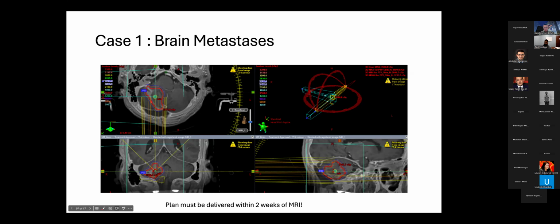There is retrospective evidence that for cavities, the tumor control is better with 3 fractions or 5, and the toxicity is less with 3 or 5 fraction radiosurgery. So that is why for patients who can stay in the area, and if there's enough machine time available, 3 fraction radiosurgery does make sense.